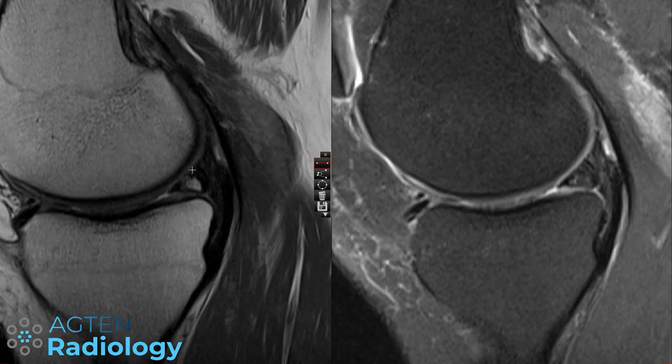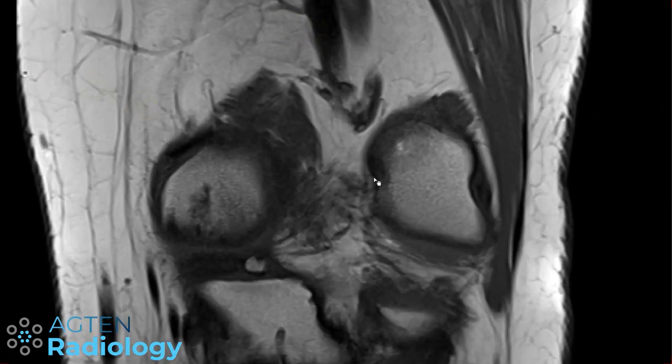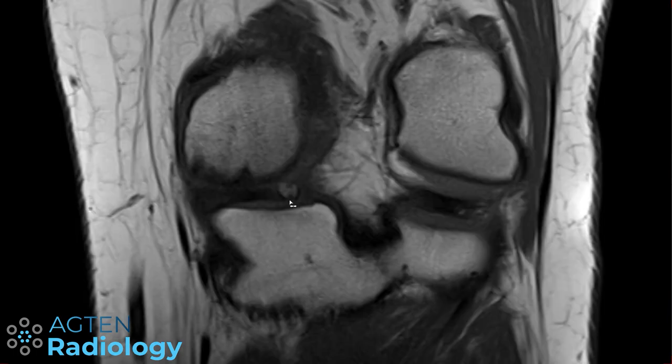Best thing to do, as always, is to have a look at your other sequences. You can see here, this is the same level. We have a loss of signal intensity in the fat-saturated sequence here. Therefore, it's fatty centrally. It has the same behavior as bone, so it's probably bone. And therefore, we are dealing with an intrameniscal ossicle here. This is even better depicted here on this coronal view.